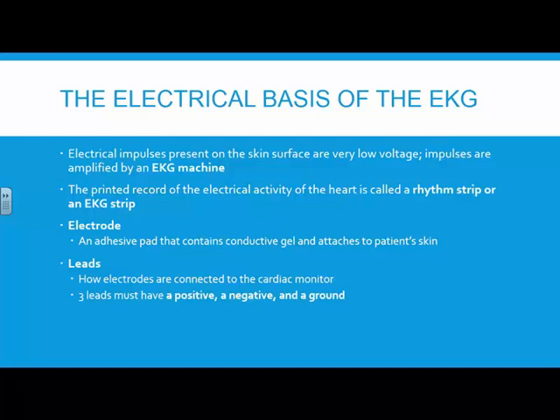And the reason why I brought up Johnny and Roy is what you'd see: just a green complex and it would disappear. And the green complex and it would disappear. Nothing like what we got these days. So they would have to print off a whole strip, then evaluate it.